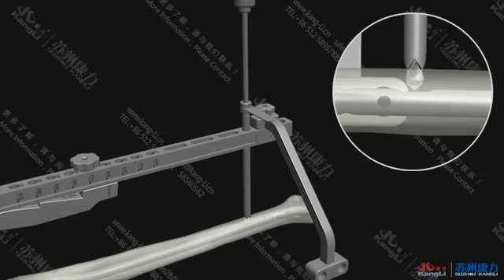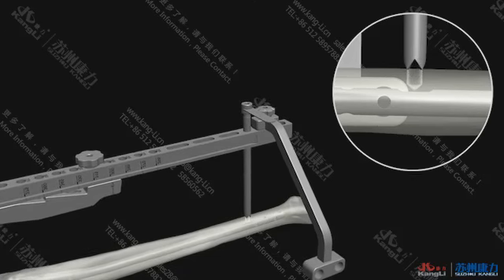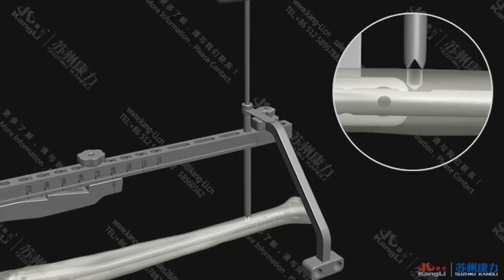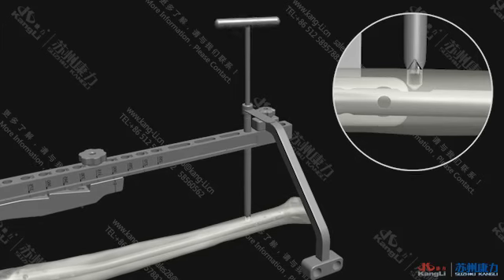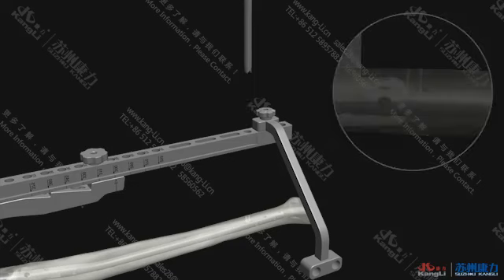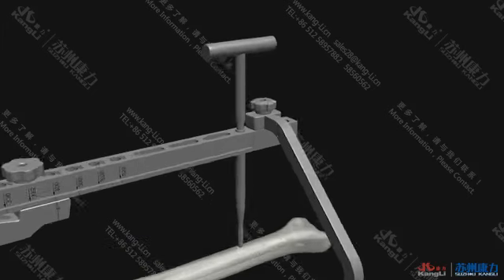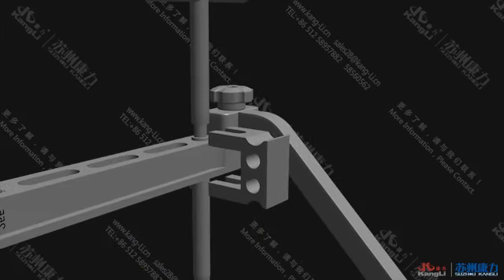Remove the 5.2 drill bit. Insert spot facing to clean the residues. If a metal noise is heard, it can be confirmed that spot facing has reached the positioning platform. Finally, insert the T-positioning rod and install the U-fixture block, then positioning is finished.